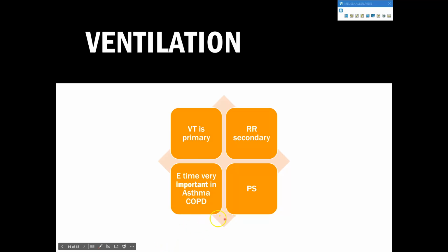And then again, with our COPD and asthma, or even anybody really, if your IE ratio is set improperly and you're not able to have enough E time, that's going to impede your ventilation or CO2 removal. Ventilation should be considered CO2 removal. They could be used interchangeably. Okay.